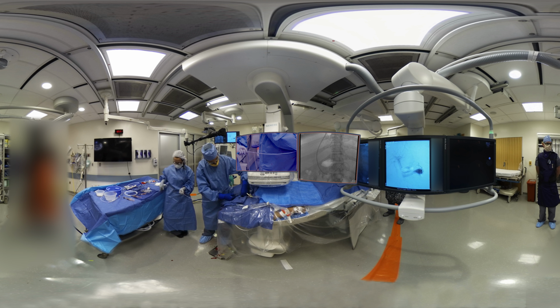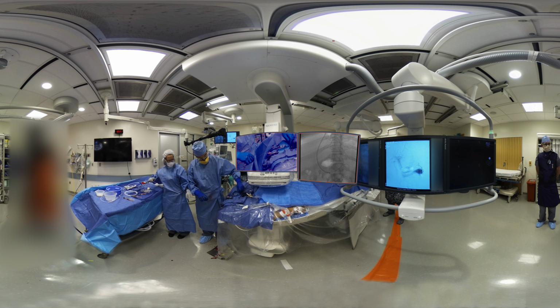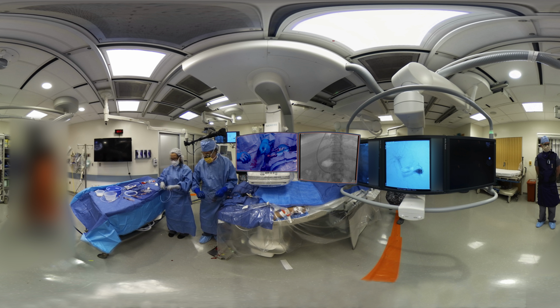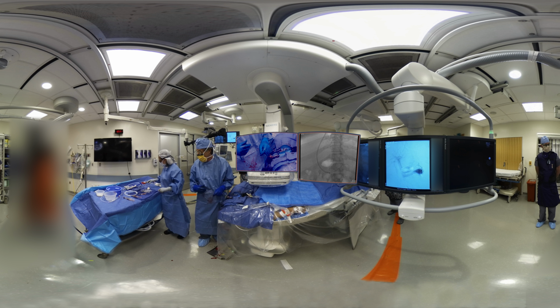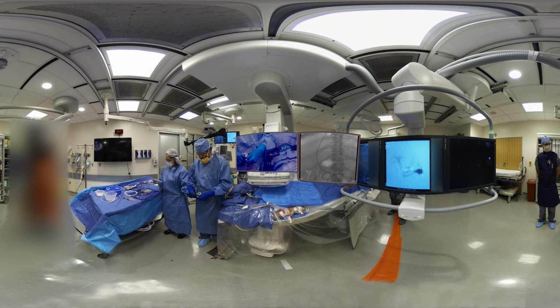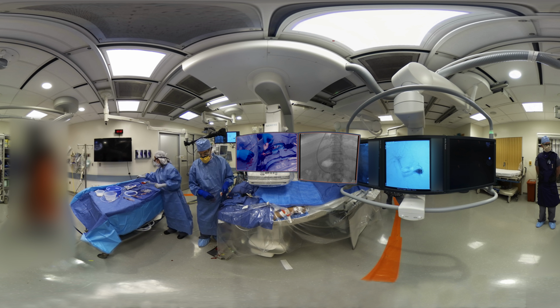And there's the balloon. So, okay, I'm going to push the balloon back off to you. Pulling wire towards you. I have the wire, and we'll need to wipe that. Wiping a wire toward is always more sound than wiping back because there isn't a chance that you'll inadvertently remove the wire.